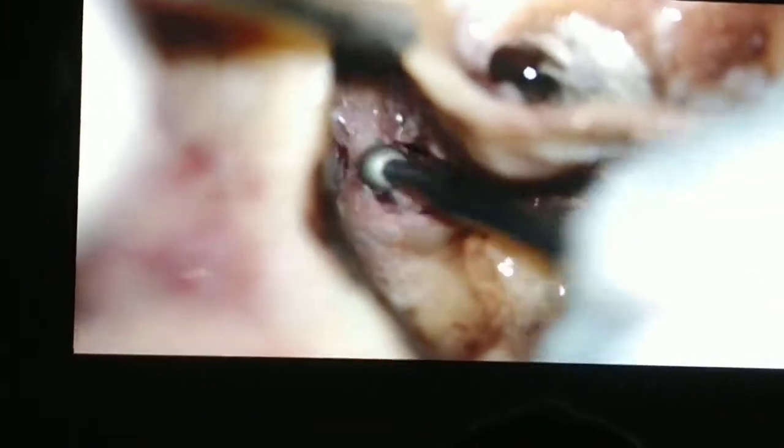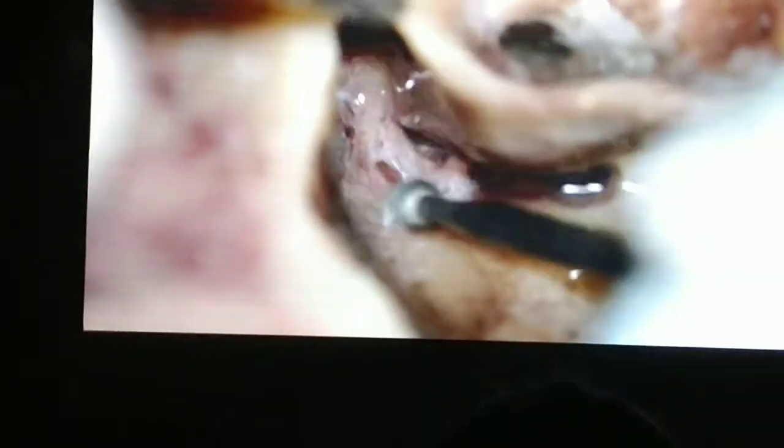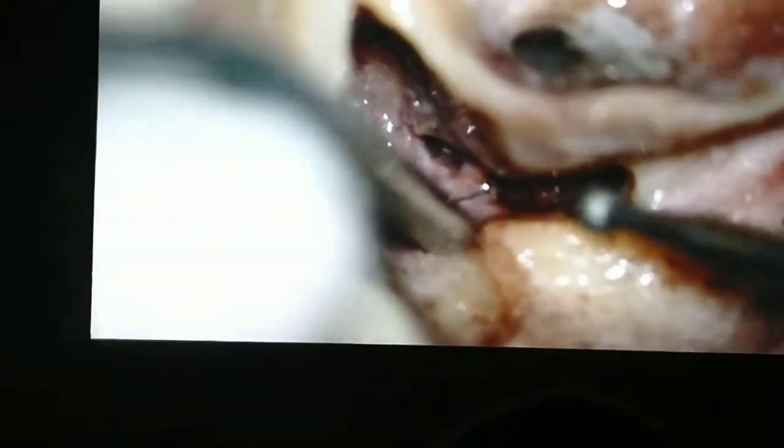We just had a discussion — a senior person is asking me: is it necessary to remove the head of the malleus to go to the genu? It is not necessary to remove the head of the malleus. You can go under the head of the malleus. Of course your burr point is going to touch the head of the malleus, but it is not going to touch the articular surface of the malleus.